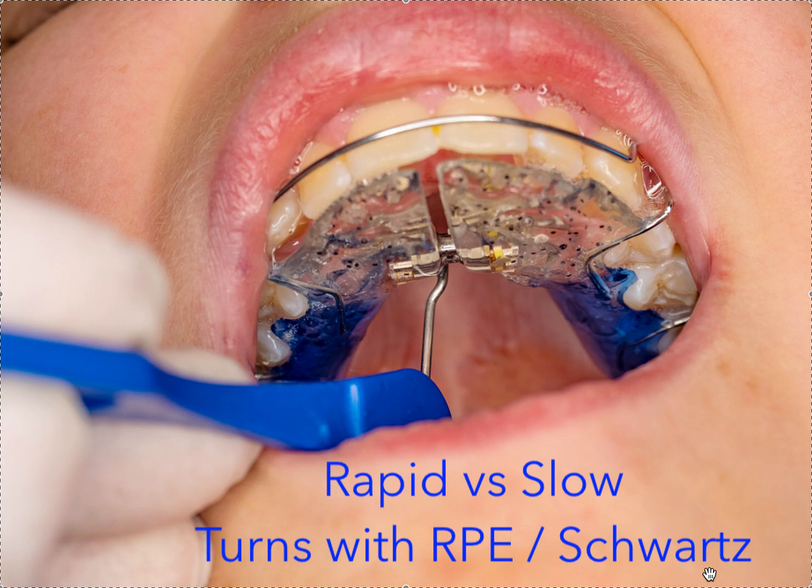So I'd rather find that out before we tip the teeth and blow them through the bone, which is what can basically happen. I can tell, when the patient comes in, if they weren't wearing it consistently. And I don't want to get to the point of no return where I've damaged the roots and teeth. So at least they come back in 4 weeks, I know. Secondly, we don't have the ugly gap. Third, we don't have all the pain and the drama at home. It's just, for me, it works better. So that's the way I do things.